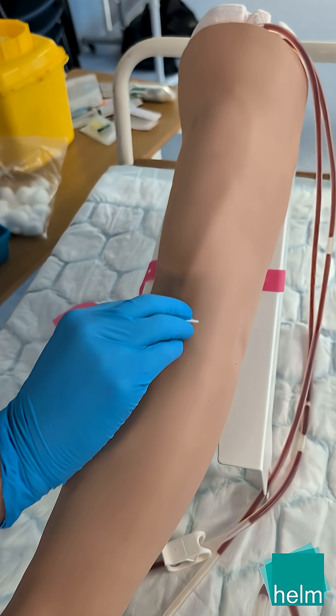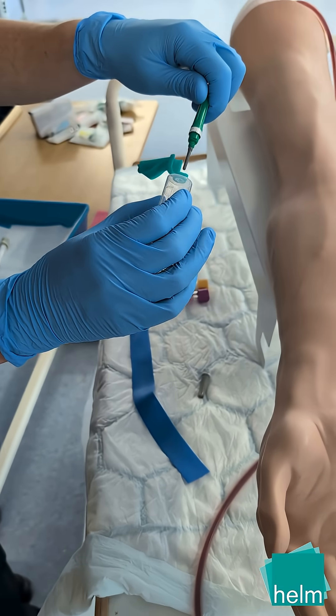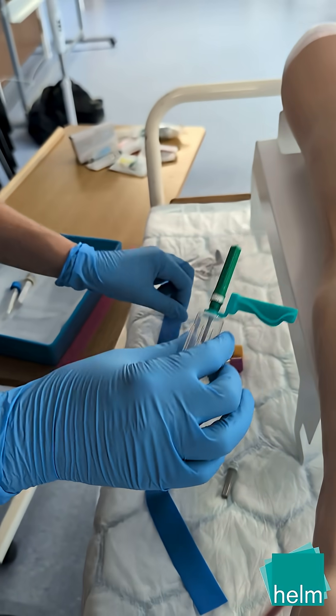Cleanse the selected site with an alcohol-based wipe and allow to dry. Select an appropriate needle gauge with vacuette, such as this green needle demonstrated.